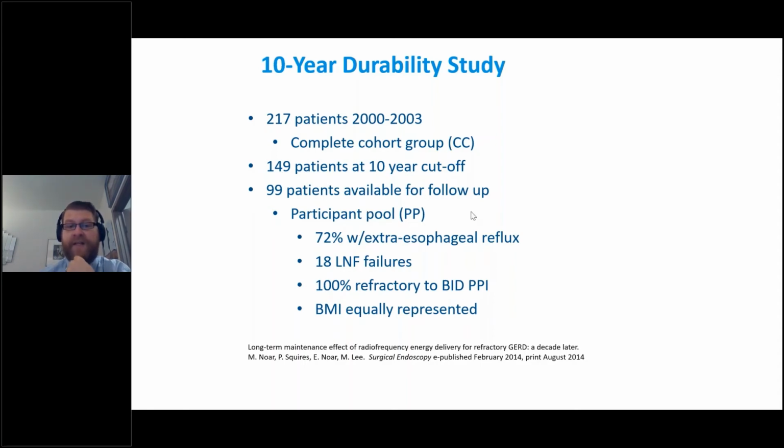In terms of reflux hypersensitivity, there's actually a bit of a split on this in the literature. For some of those patients, if it's not a functional problem with demonstrable reflux, then we have not found that reflux hypersensitivity is a patient population that Stretta benefits. And in fact, there was a recent study that had a number of patients who had hypersensitivity, but who did not have functional reflux. With those patients, Stretta didn't really have a meaningful difference, because even if you expand that lower esophageal sphincter and improve the lower esophageal sphincter, they still have that hypersensitivity. So really with Stretta, we're talking about patients who are suffering from GERD in a much more classical sense. That's really the patient population where we have the highest degree of success.